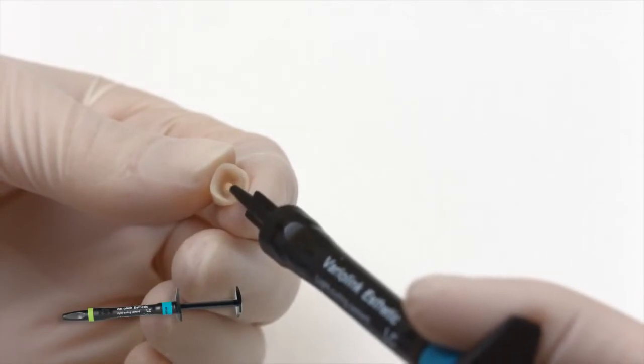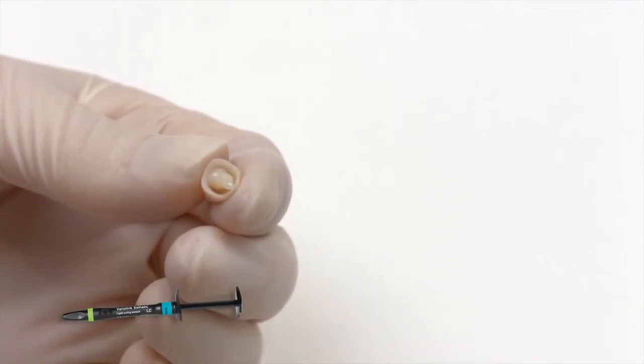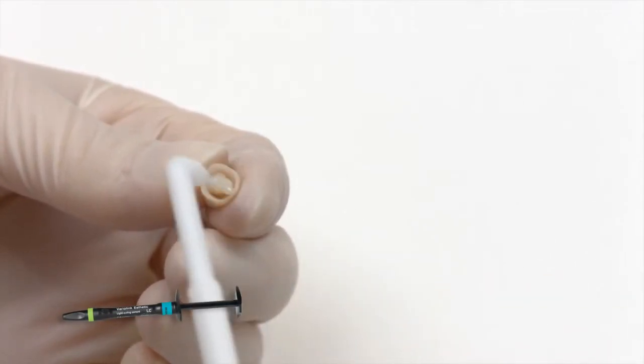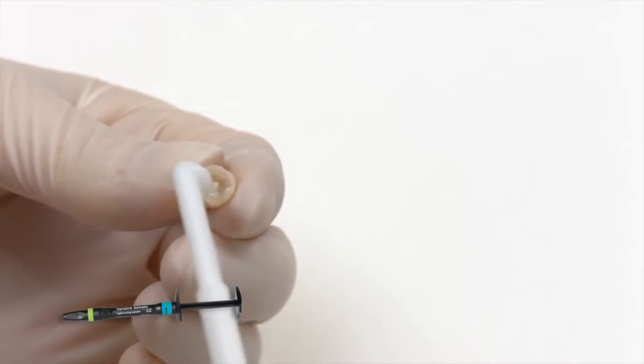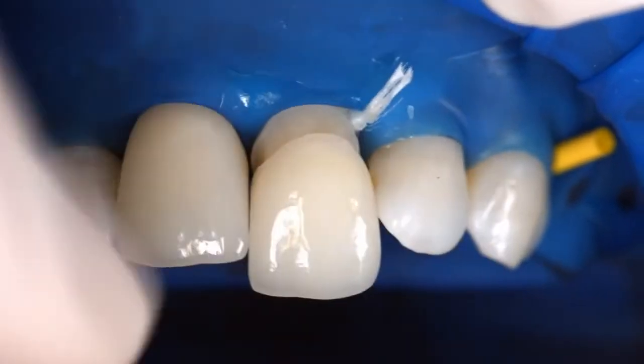Apply the desired amount of Variolink Aesthetic LC directly from the syringe onto the restoration. Seat the restoration and retain it in place exerting uniform pressure.